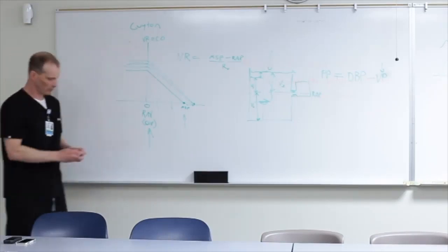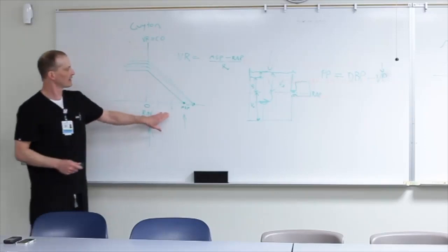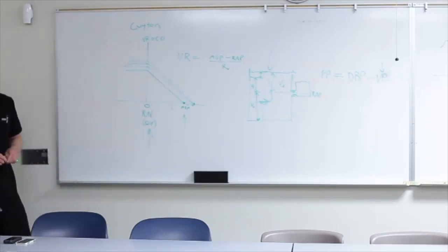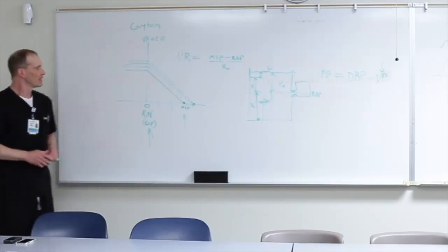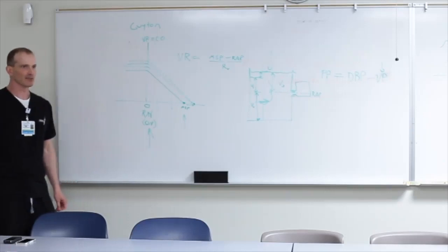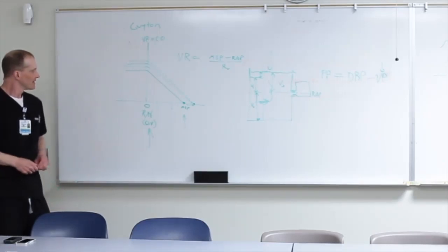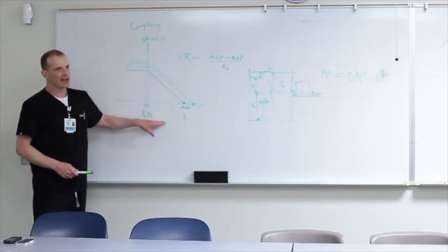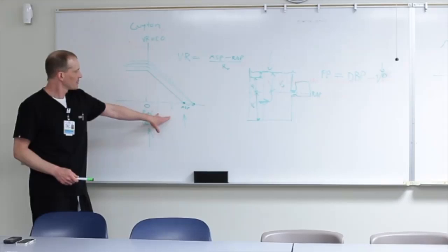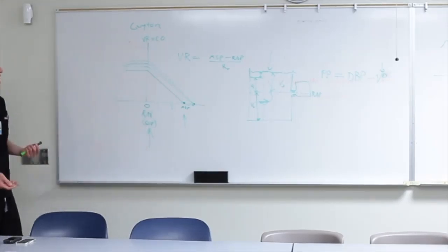So really, what we're talking about when we're looking at an IVC, I think, is not volume responsiveness, because if we wanted to really do that, we need to go to the left ventricle and interrogate what's happening at the LVOT with the volume challenge, okay? That's the best way to predict that. But there's too much in the way here to really predict, with a reasonable amount of certainty, if we should be giving fluids or not.